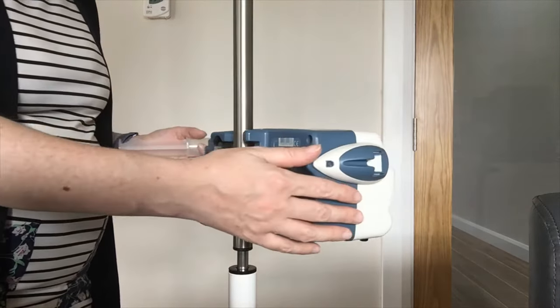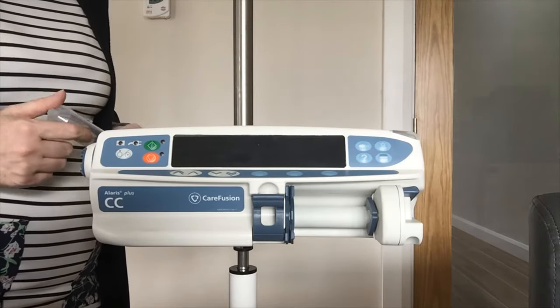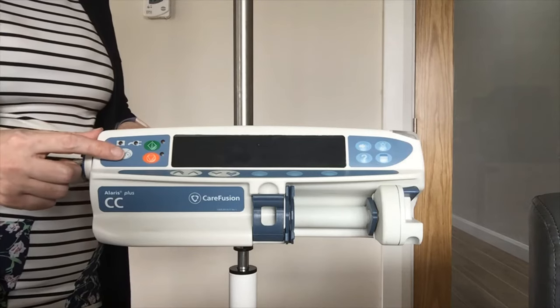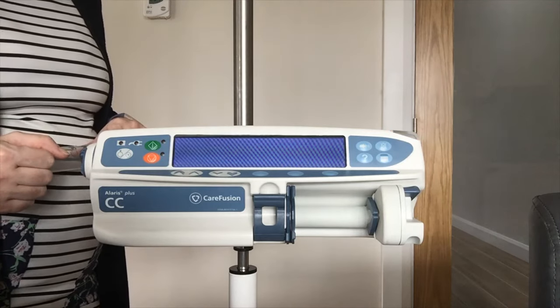Best practice is having the pumps charged at all times, but battery backup is 4 to 6 hours depending on your rates. To power on this pump you have got your power on key which is the white key — press that once and it will start going through its self-testing.